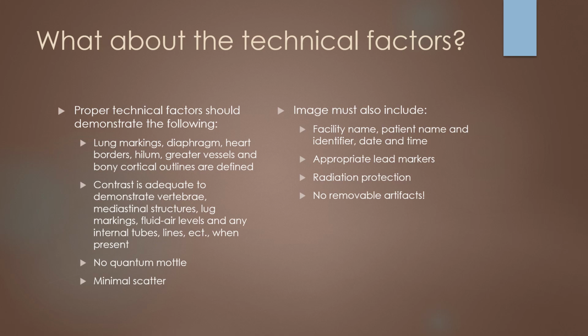Okay. And then finally, here are those image evaluation musts, or those legalities that have to be on the image. Make sure patient name, facility, identifier, date and time, as well as a lead marker is on the image.